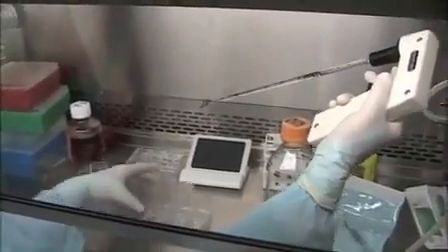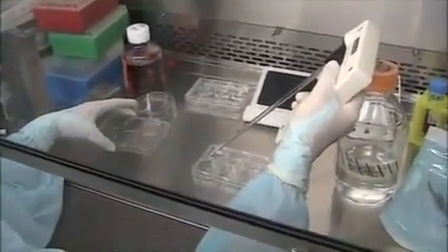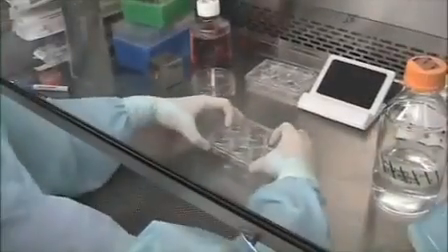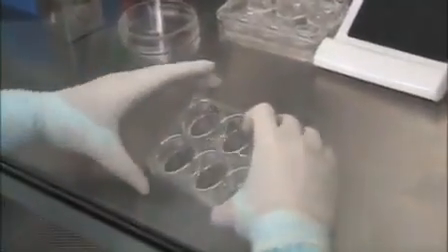Add one milliliter of 0.1% gelatin to each well. Swirl the plate around to ensure that the bottom is coated with gelatin. Let the plate sit for an hour before use.